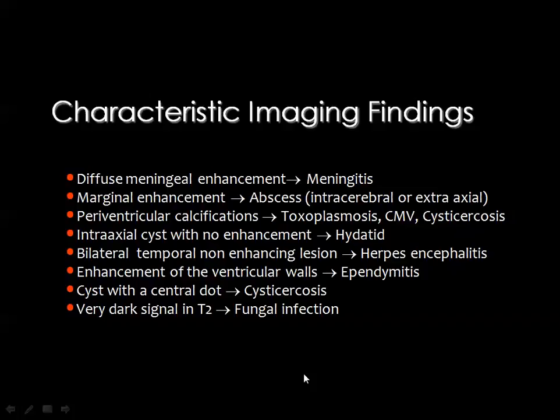And finally, we came to a conclusion, or what we may call the take-home messages. You remember that we have mentioned that diffuse meningeal or leptomeningeal enhancement is diagnostic of meningitis. Marginal enhancement of an intraaxial lesion is diagnostic of an abscess. If it is extraaxial, you diagnose epidural or subdural empyema.